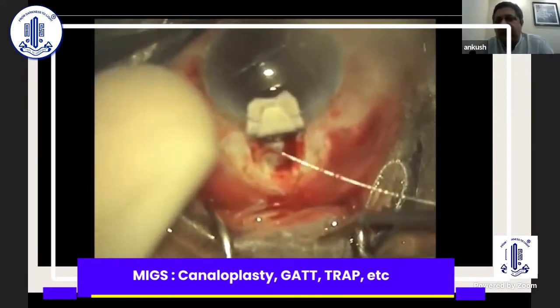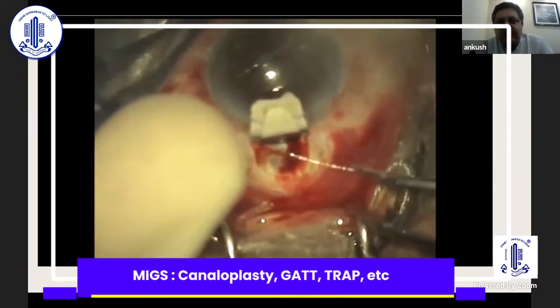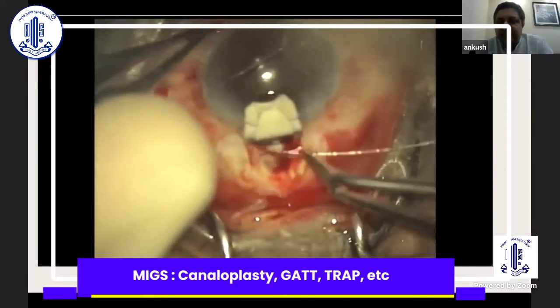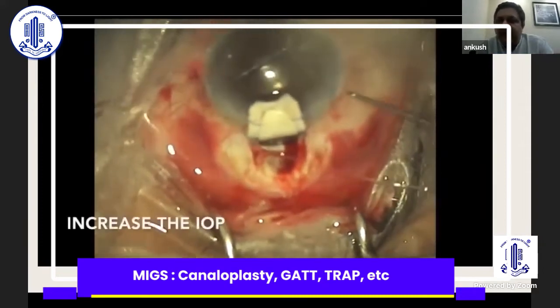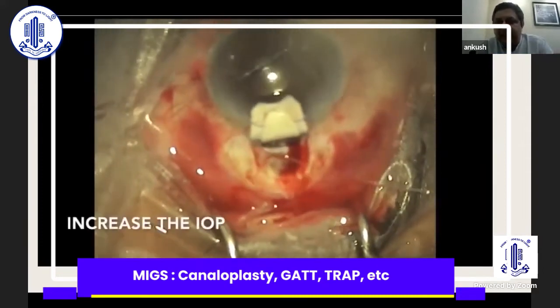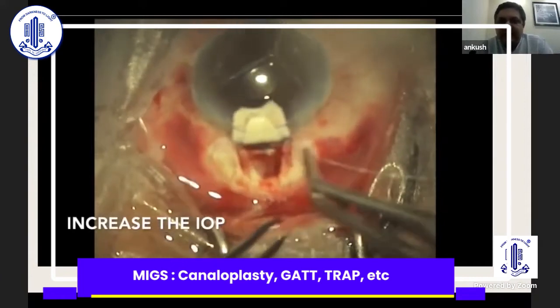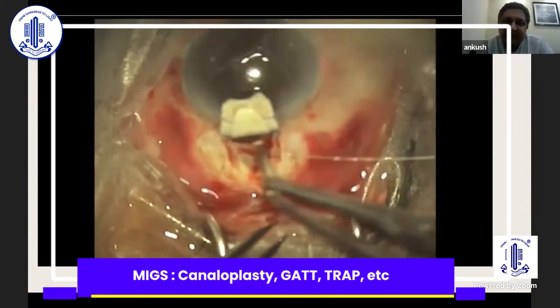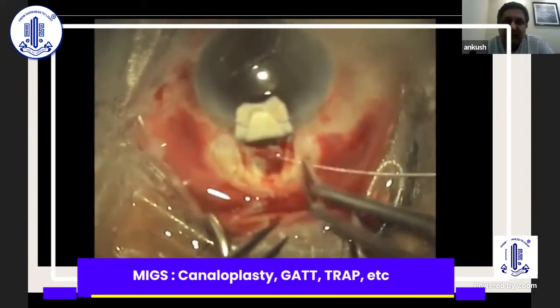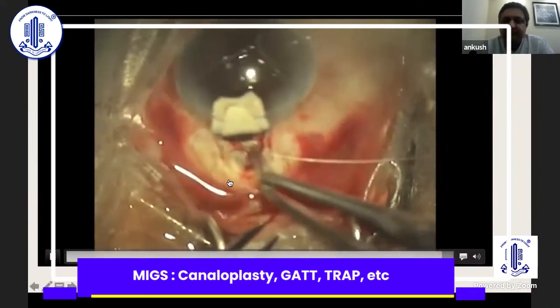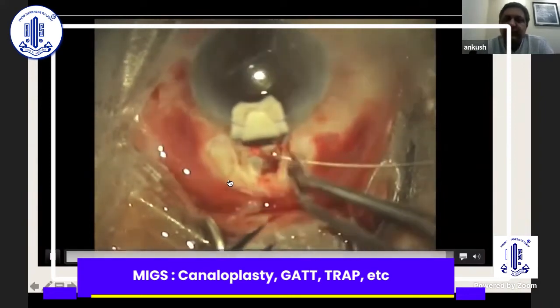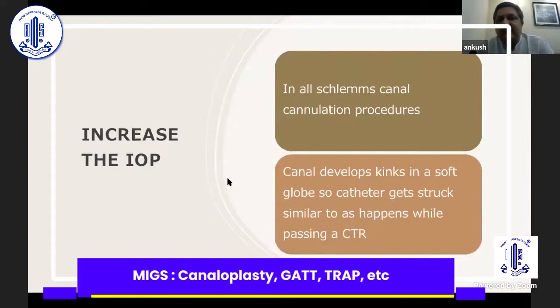What I did was stop there, use a 2cc syringe with BSS, and introduce the BSS into the anterior chamber to increase the IOP. When you increase the IOP, the kinks in the canal dissolve because the pressure increases and the catheter is able to pass through. So in any canal-based surgery, when you are trying to cannulate, maintaining increased IOP is very important.